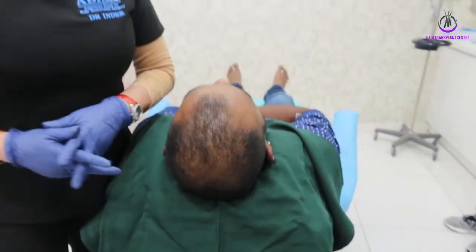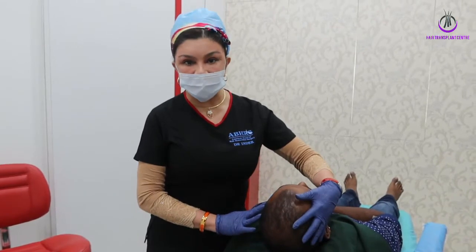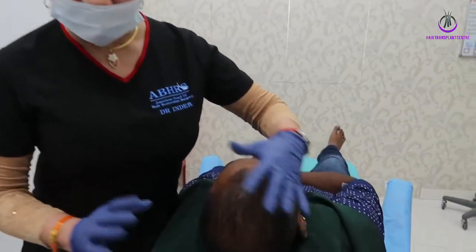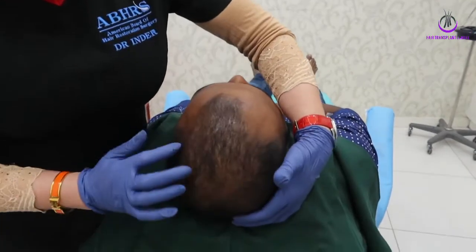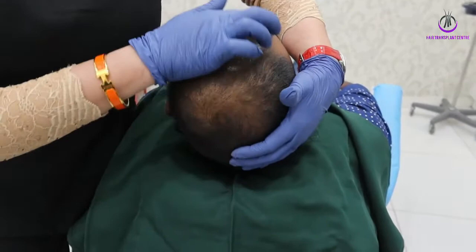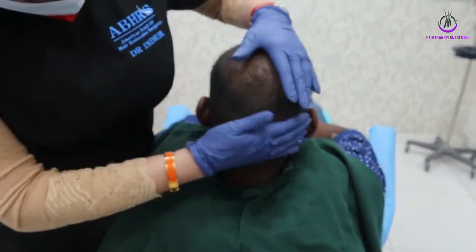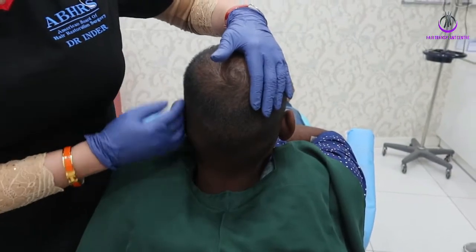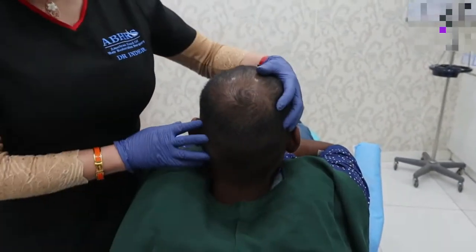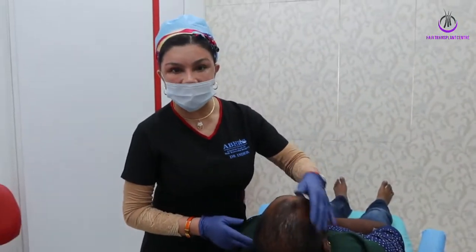What I'm going to do shortly is a very conservative hairline for his age of 27, and then a very conservative planting of the hair in the area that is lost, from the hairline to the crown. If you look at his donor, you see he has shaved his donor very short, to number 1, before he came, otherwise his donor density is alright. So today is fully shaven FUE.